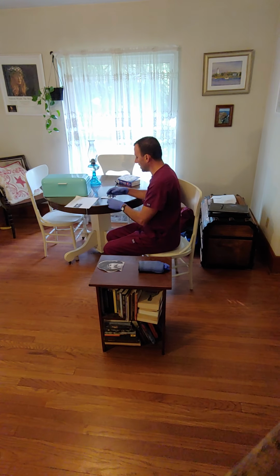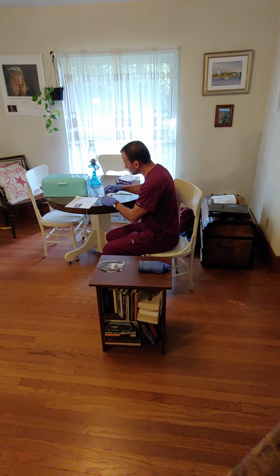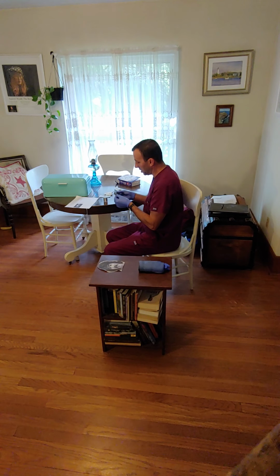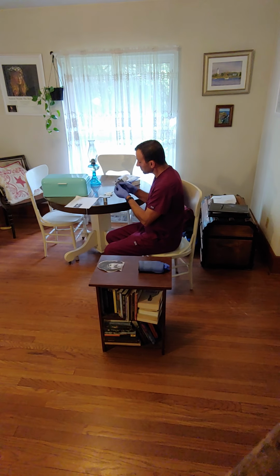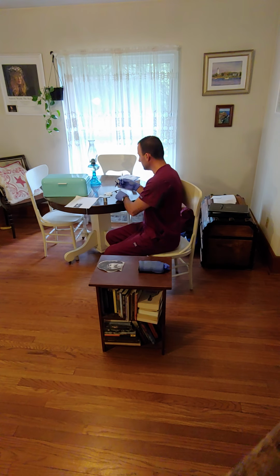So we're going to assume that this has not been opened. We're going to take off the cap. We're going to get one of our alcohol wipes and scrub the hub for 10 to 15 seconds from inside to out to make sure that we're not contaminating our needle. So we have decided to go with a 22 gauge, 1 inch needle. Mr. Prine does not have a lot of adipose, so the 1 inch is going to be appropriate for him, and the 22 gauge is appropriate for an intramuscular injection. So we're going to go ahead and open that up and take it out. We're going to uncap it.